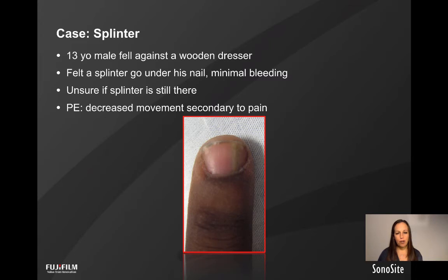Now, this is actually one of my favorite applications because I absolutely hate foreign bodies. I hate hunting for foreign bodies, and I particularly hate foreign bodies under the nail. So this was actually a patient with a suspected foreign body, and I performed ultrasound to prove to the mother that there was not a foreign body, and I was wrong. So be careful when you're using ultrasound to rule things out. We really want to rule it in, and luckily I actually did rule it in for the patient.